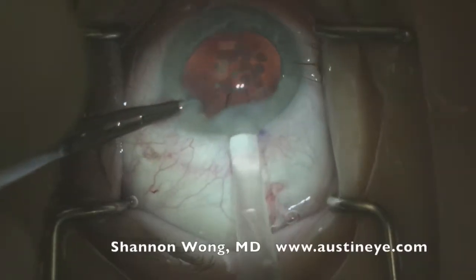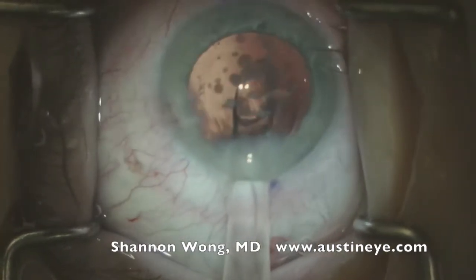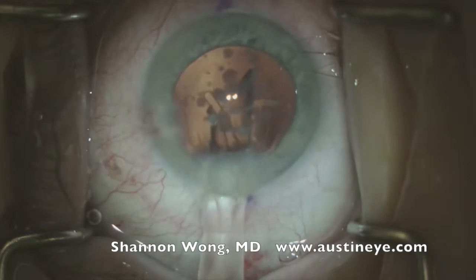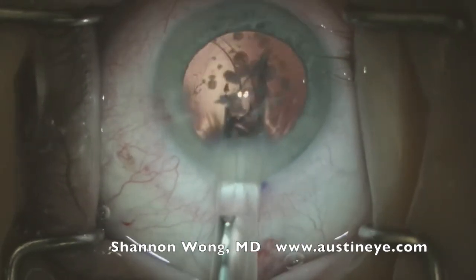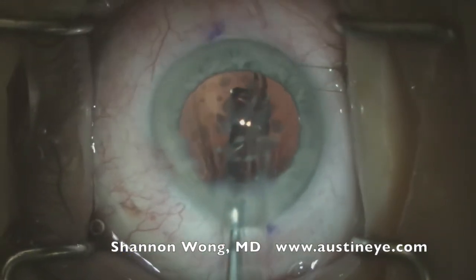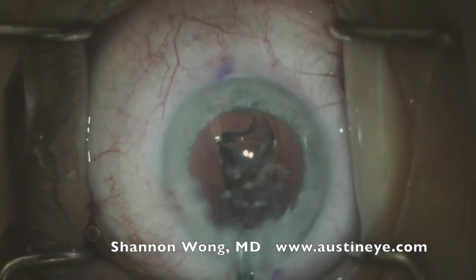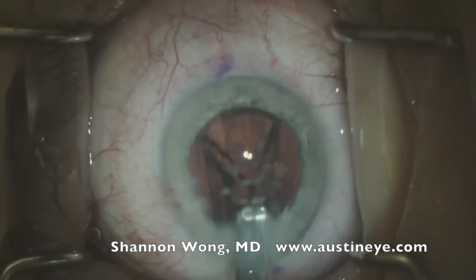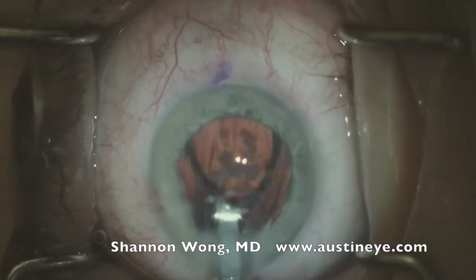Here we insert the Tecnis toric lens. This patient had about 2.5 diopters of astigmatism. We were able to obtain a reliable keratometry reading using the LensStar prior to surgery. We normally use the Aura intraoperative aberrometer, but due to these corneal opacities, the Aura was unable to obtain a reliable measurement.